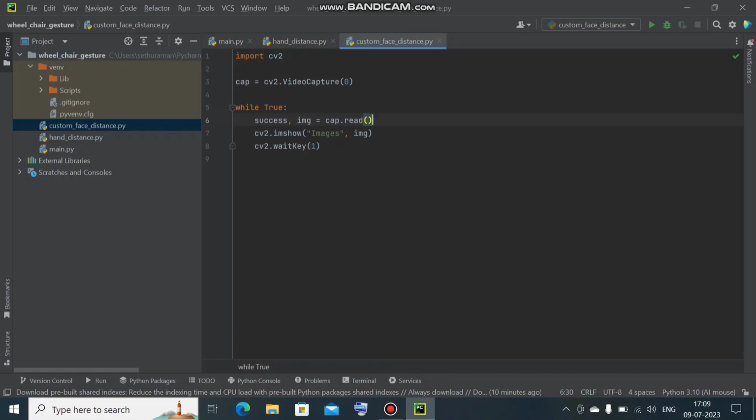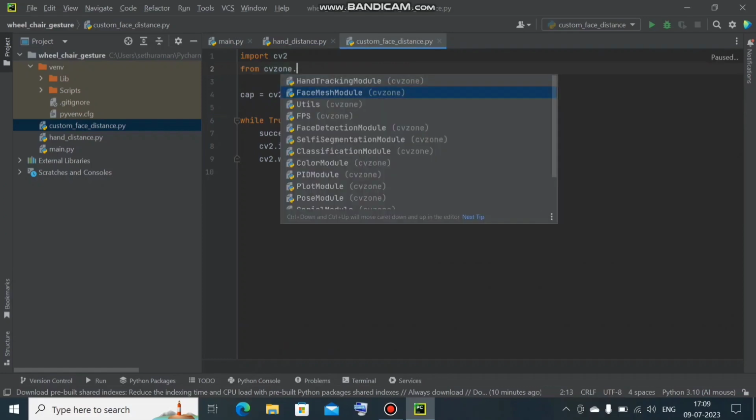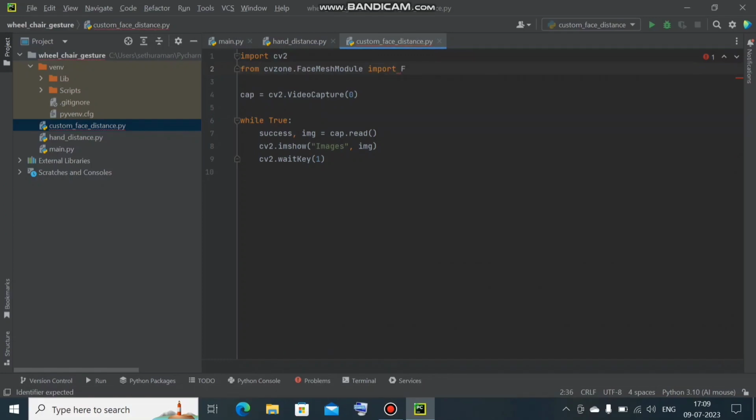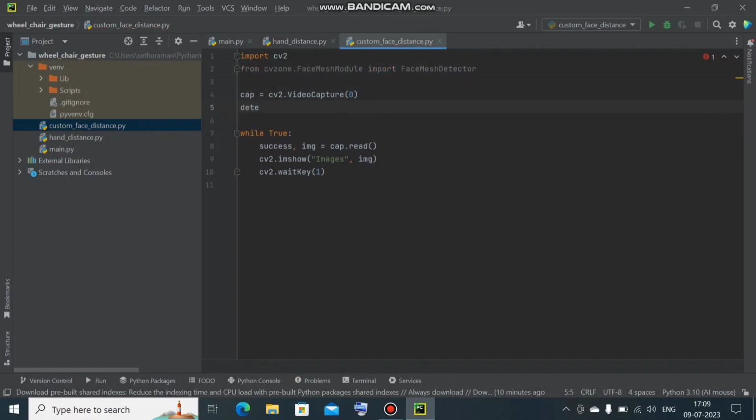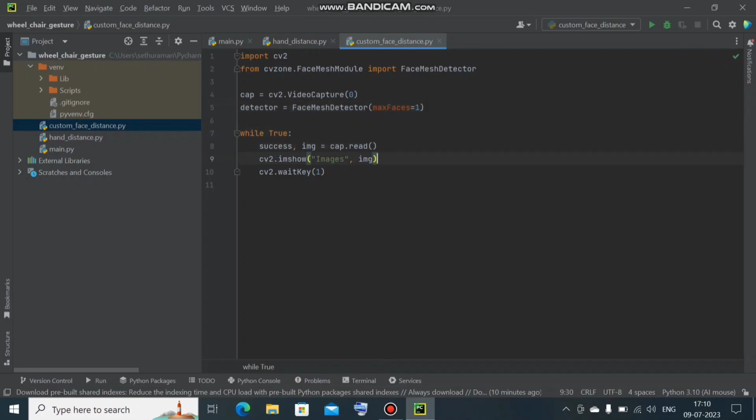So next step, we are going to detect our face using the package CVZone. From CVZone, we are going to get the FaceMeshModule, then import FaceMeshDetector. Next, in the variable detector, we are going to call FaceMeshDetector, and assign maxFaces, the maximum number of faces it needs to find in a frame, as one. So if more than one face is in a frame, it won't be detected. You can also change that to 2 or 3, whatever you need.